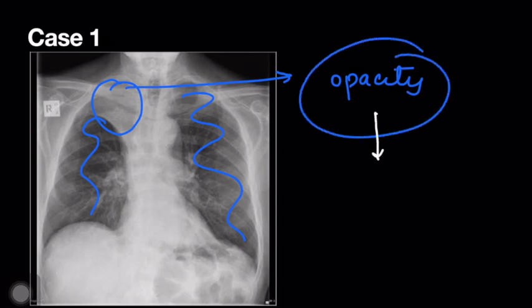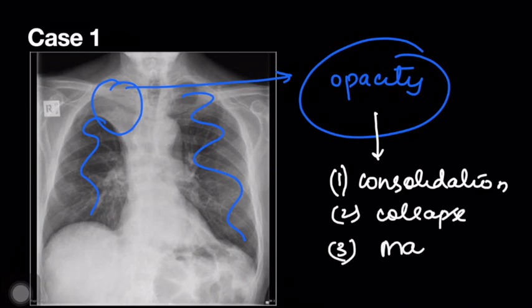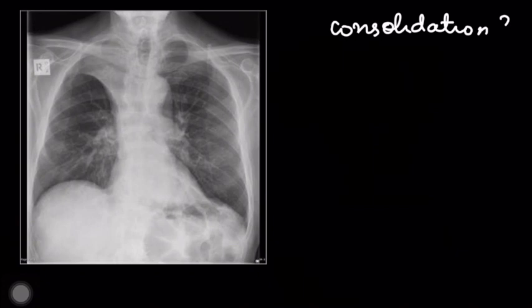Now we shall see what conditions produce opacity. It can be consolidation, it can be collapse, or it can be a mass or nodule. Let's take them one by one. First, about consolidation — so does this picture really fit into consolidation?